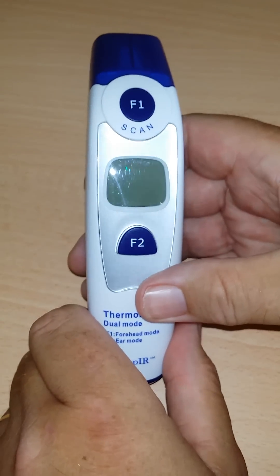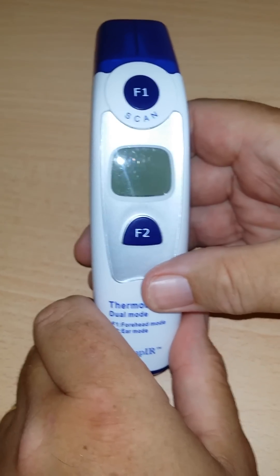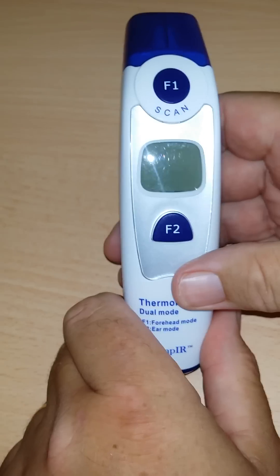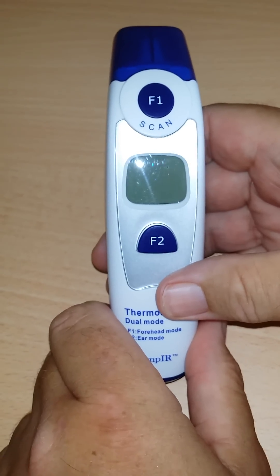Hi, my name is Andrew from TempiR. Tim is going to demonstrate how to change from Fahrenheit to centigrade and vice versa on the dual thermometer.